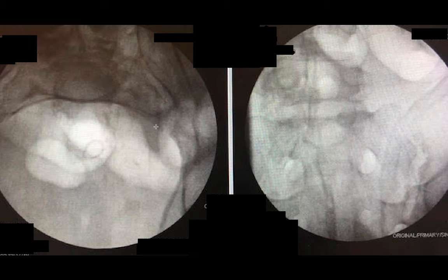So, but here you can see the gap, anterior gapping in the SI joint. You can see that pretty well. And the symphysis is not pictured here, but suffice it to say it is off as we expected it to be. The outlet view now, here seen on the right.